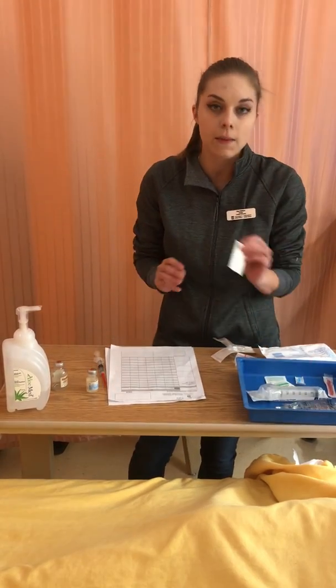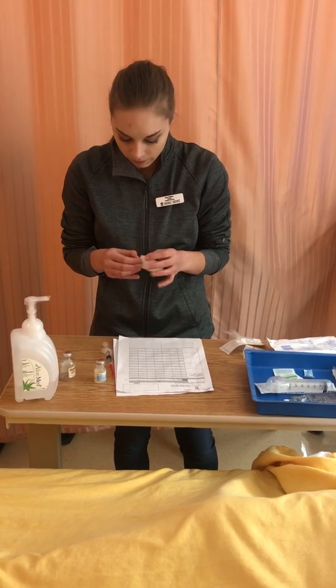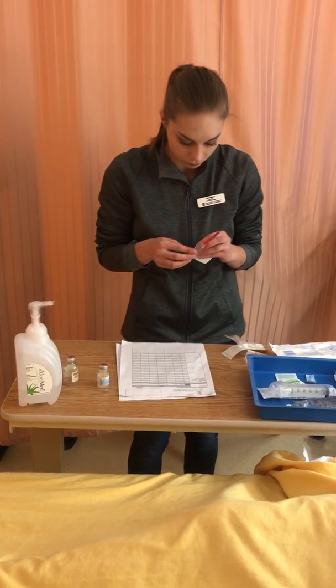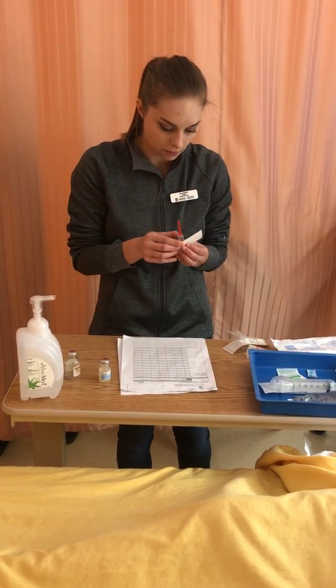And I also made a label beforehand, so I can attach that now. And now this goes on, so I don't want to cover the markings.